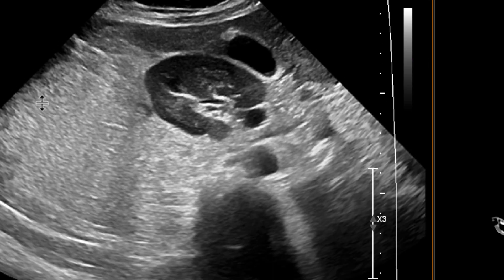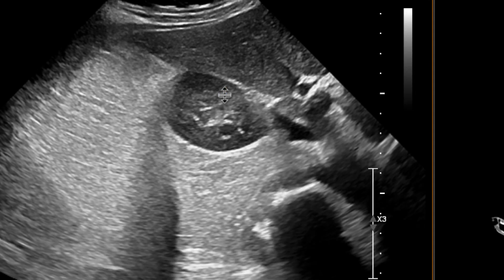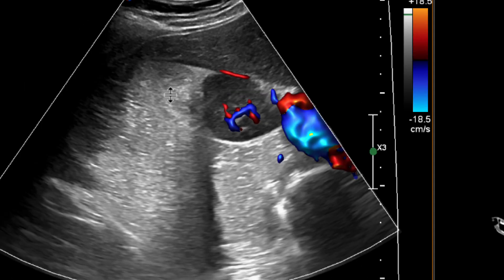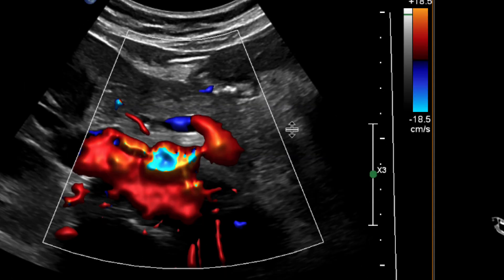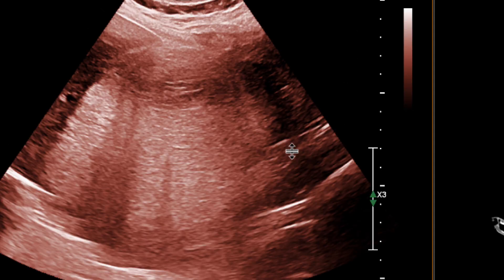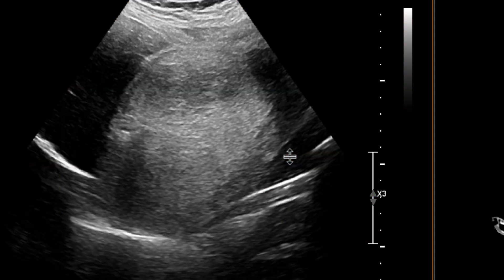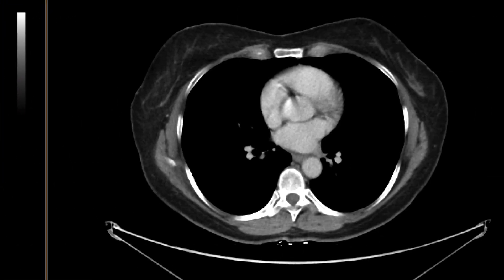It's a transverse image. Look at all this fat that's posterior to the right kidney and pushing it anteriorly. We can see more of it on this image. There's not much vascularity within that fat, and so really a large amount of fat surrounding that right kidney.